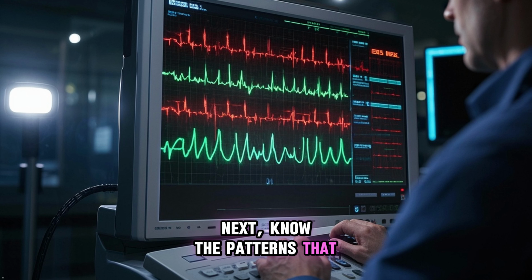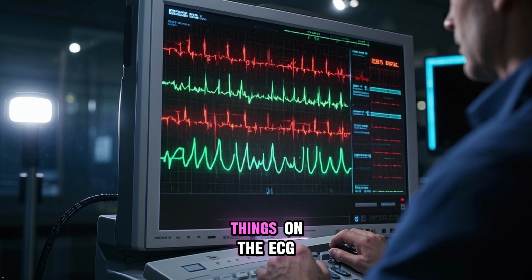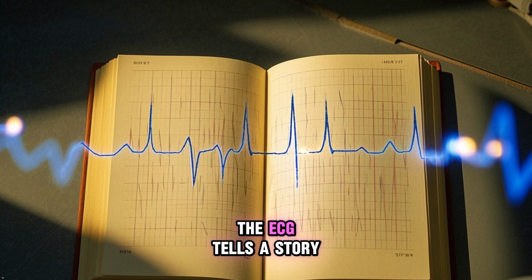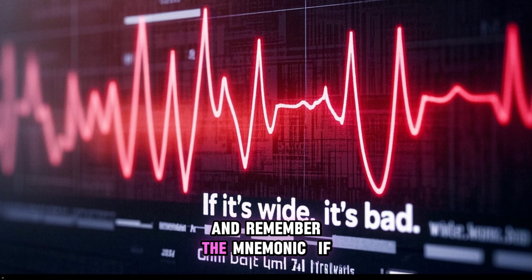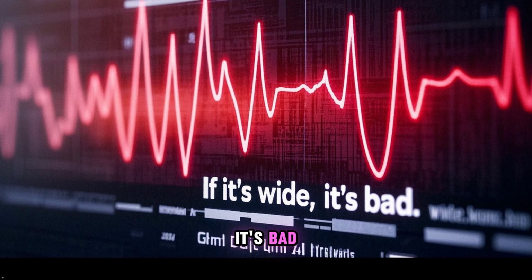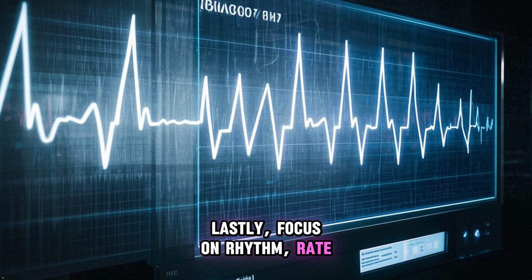Next, know the patterns that can help you identify key things on the ECG. The ECG tells a story, you just have to learn how to read it, and remember the mnemonic: if it's wide, it's bad. Lastly, focus on rhythm, rate, intervals, and wave patterns.